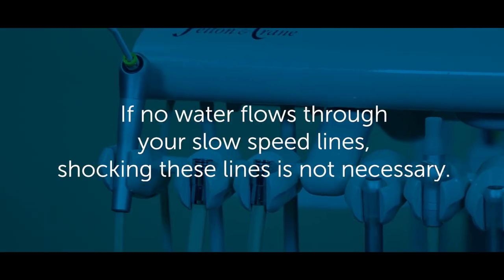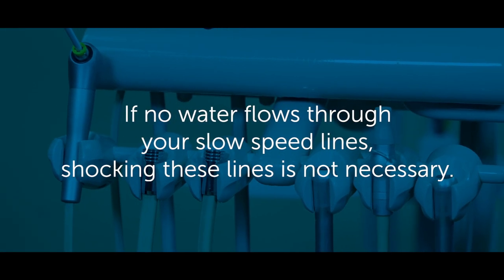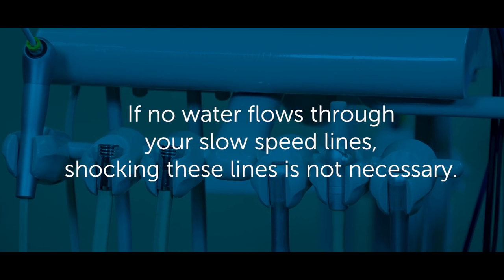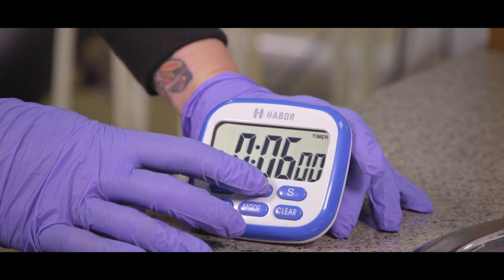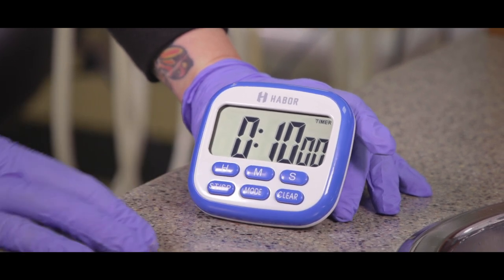If no water flows through your slow speed lines, shocking these lines is not necessary. Also, scalers tend to have longer lines, so run the scaler for at least one minute to ensure that the bleach has entered the line. You want to leave the bleach in your lines for only 10 minutes.